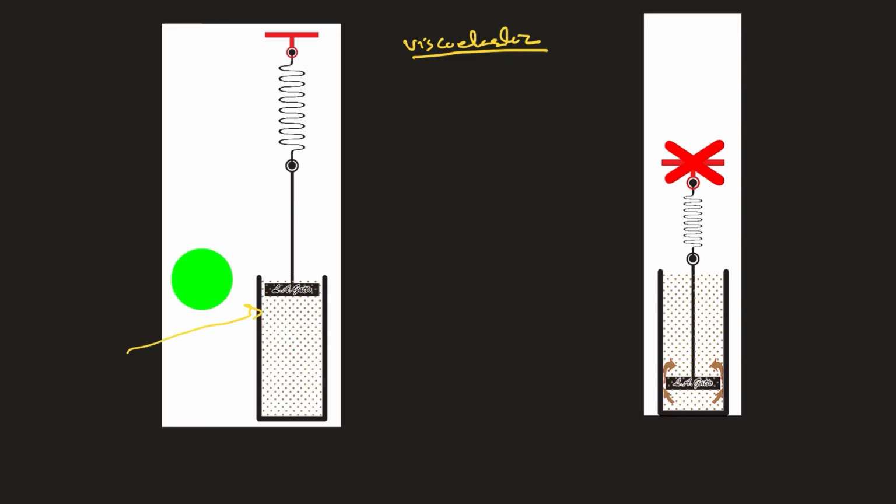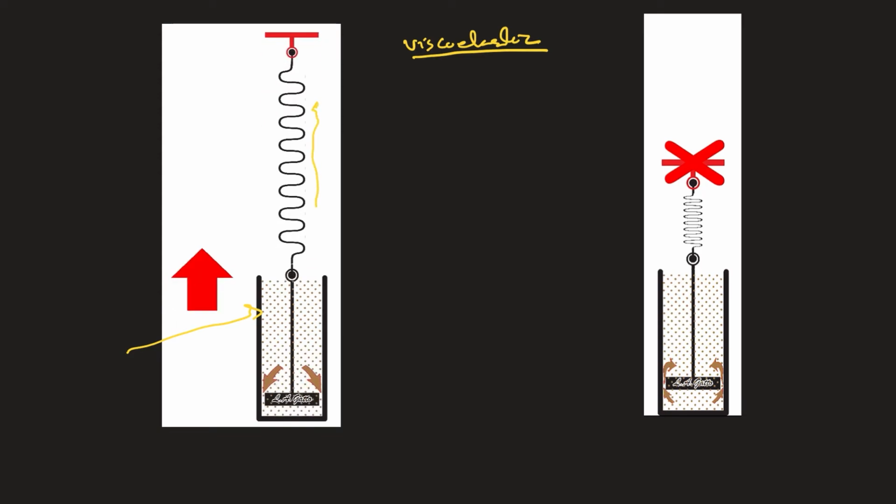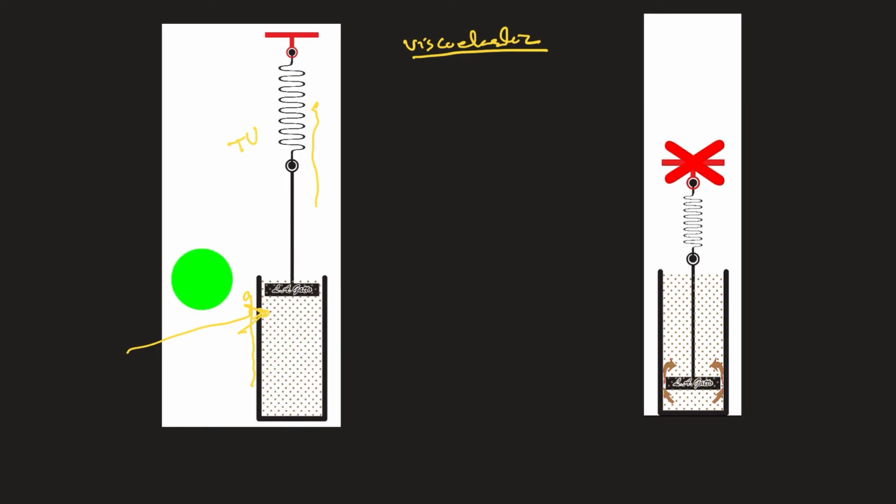So again, I'm going to repeat. See, the spring represents the tidal volume and the dashpot represents the recruitment of the alveoli. And see the lag. See the spring quickly going up. See the dashpot slowly going up. So this is the tidal volume and this is the alveolar recruitment. See how it lags and slowly gets recruited after that.